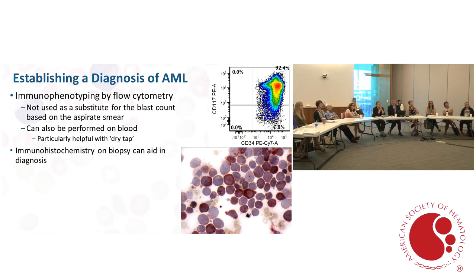And these are the loopholes where we talked about 20%, but these are the only three situations in which you can make a diagnosis of AML with less than 20% blasts, and it's defined by the karyotype or by FISH. These can be done fairly quickly if needed. The inversion 16 can sometimes be difficult for the cytogenetics lab to determine, especially if the material isn't that good, so it's nice to have the FISH backup. The manufacturers are coming up with more rapid hybridization buffers that allow the labs to do these FISH studies in a few hours, which is also very helpful.